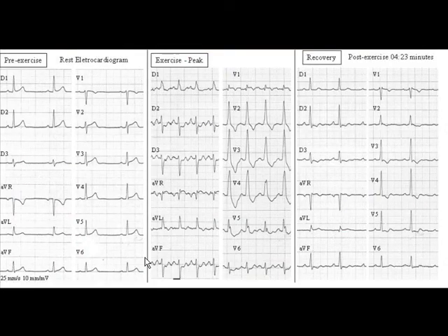Okay, just to reiterate the points that I was making in this, I pulled this EKG off the internet. It's at www.ipej.org/0602/UCHIDA1.jpg, and I'll put this on the YouTube. But anyway, I just wanted to show that here is a person, and we'll just look at lead 1, who was pre-exercise, and it looks like a pretty normal EKG, P, QRS, and T.